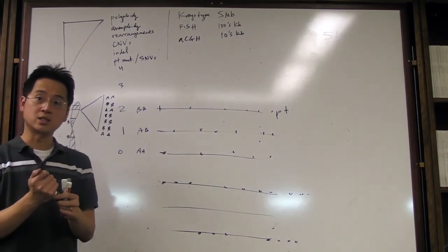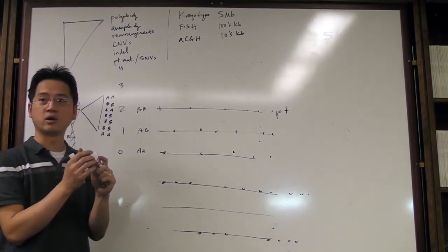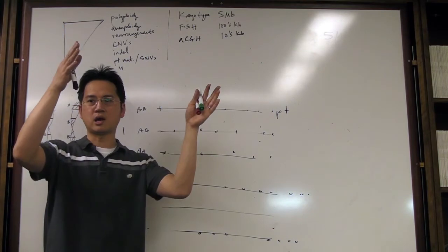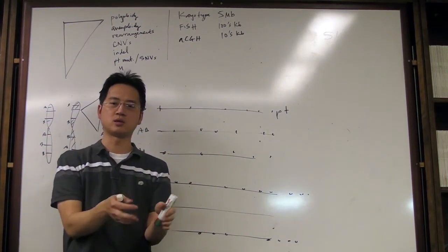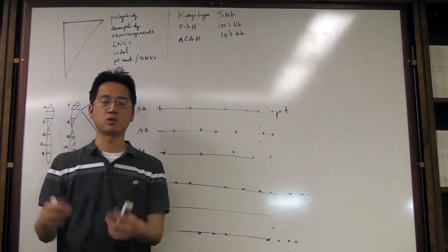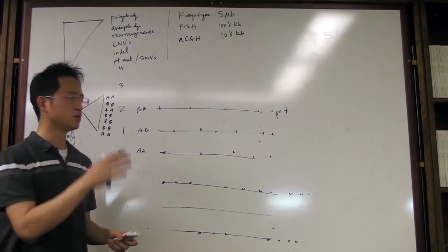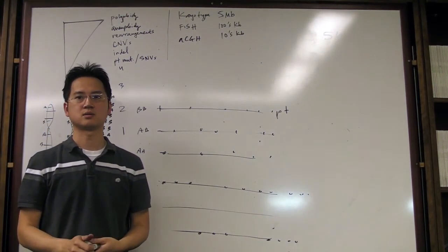For a consanguineous case where you have cousin-cousin, brother-sister marriage or whatever going on, you will see this throughout the genome. It's just 20 million bases here, 40 million bases there, 10 million bases here, just peppered throughout the genome. And that's represented by the crossing over events during gamete formation. You'll see it just scattered across, and it's very easy to recognize a consanguineous case.